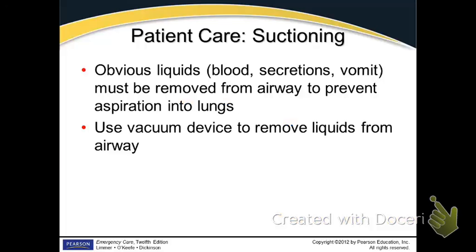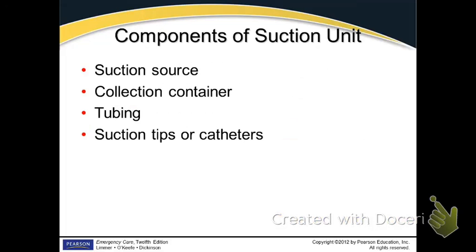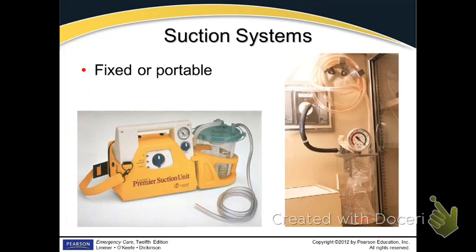All right? This works actually quite well with this portable suction. I'd rather have this over this when we look at the suctioning. So when you look at the different components, we'll look up here. Well, let me just go to this picture. I think it's next. Yeah. We'll look up here at this picture, and we have on this portable electric suction device.